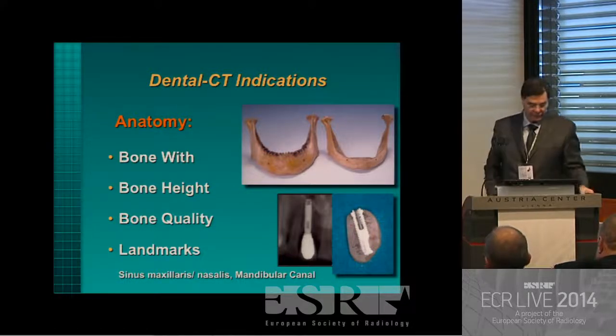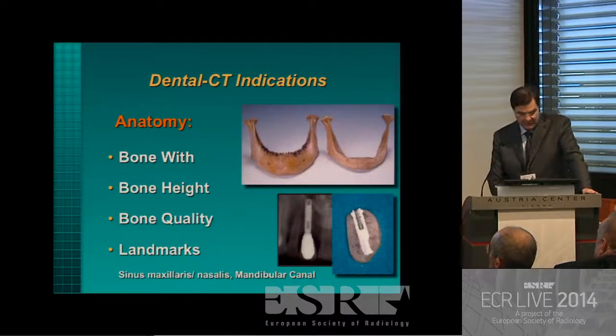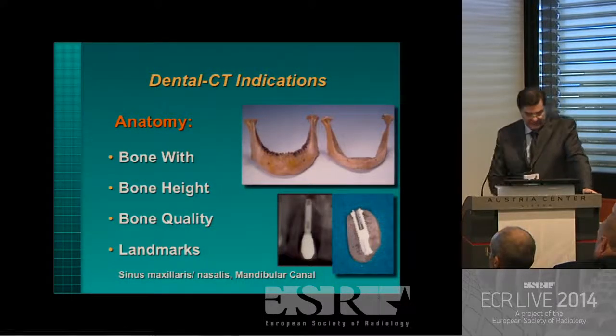teeth and atrophy develops. So you must know, when you have the jawbone, how much place you have to put inside the implant, and that is the reason why we do dental CT prior to implant placement. So you avoid perforation here into the mandibular canal or perforation into the sinus.